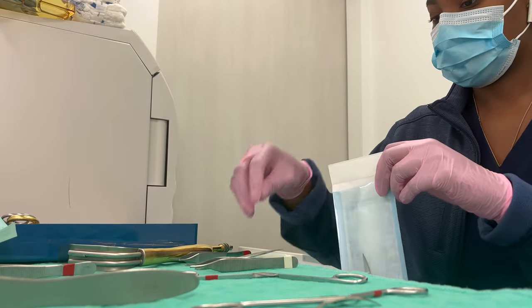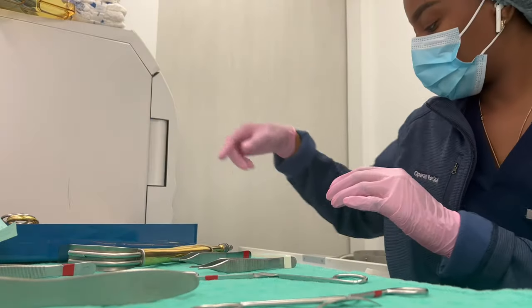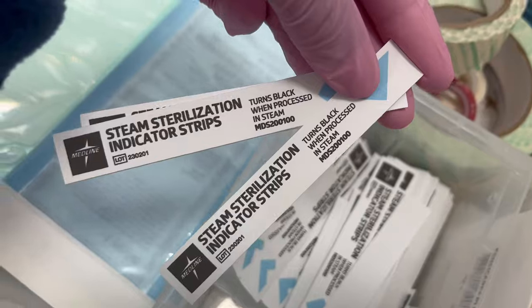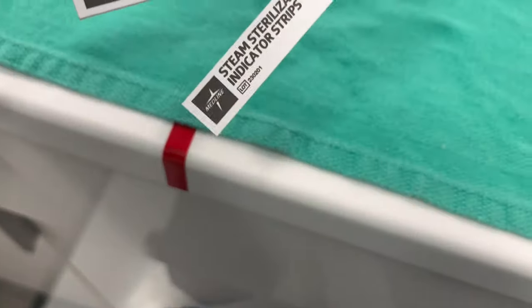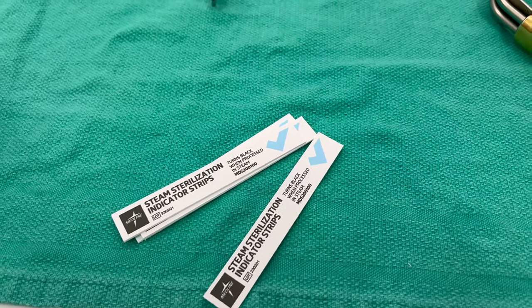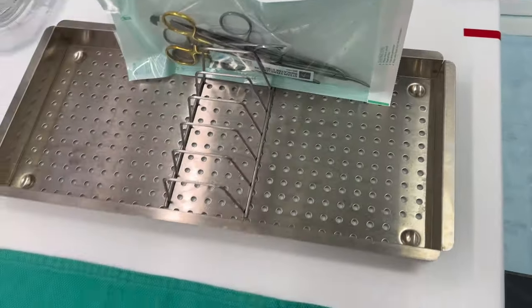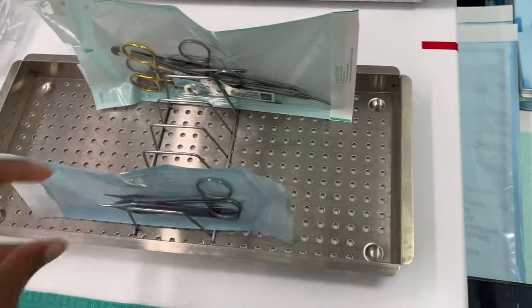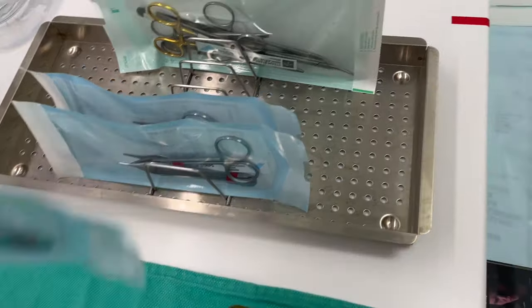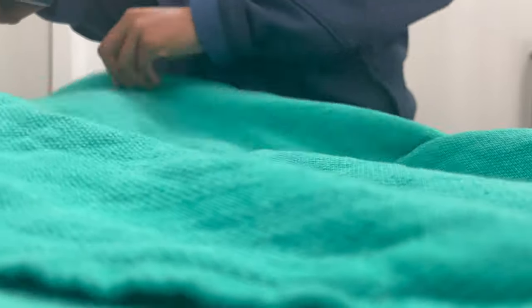And then we have these suture remover trays that we also put into these little pouches, which get used on clinical day. And those are the steam sterilizer indicator strips that go into every tray I put into the sterilizer. I write the name of the instrument on there and then the date. And that's what one of the trays looks like, organized for the autoclave. So I put that in.